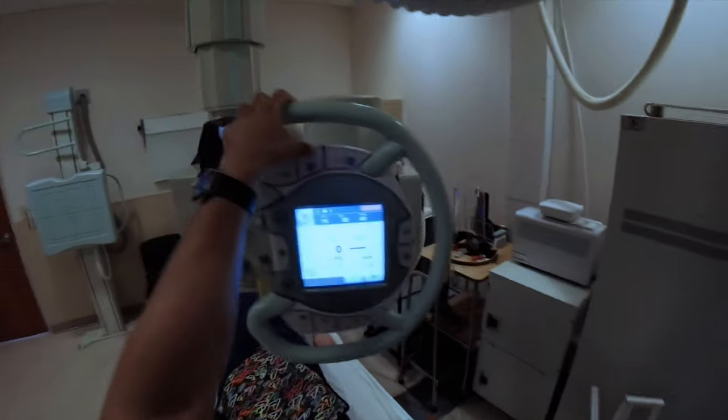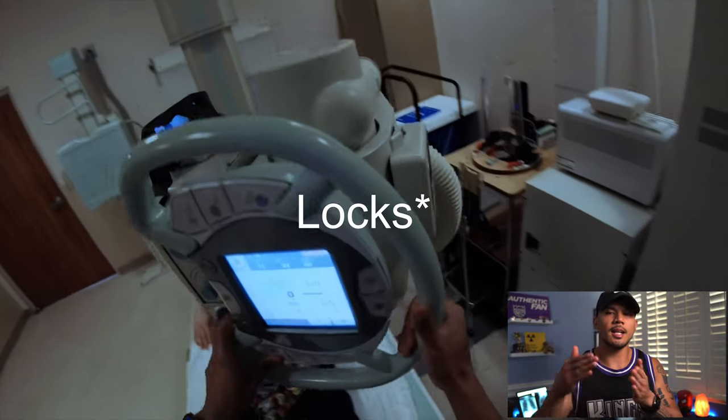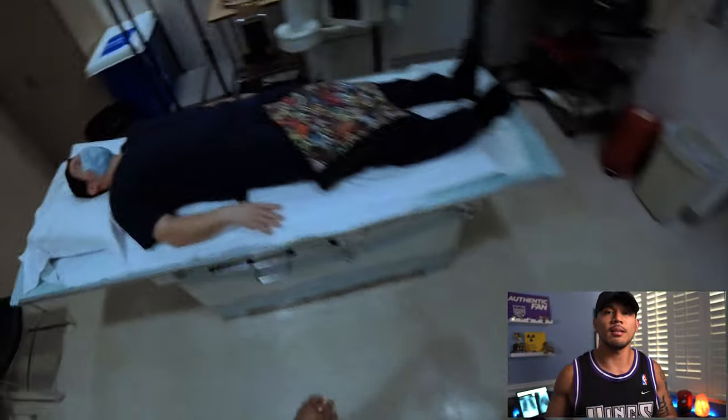Okay. So as I'm bringing the tube over, our tube detents at 90 degrees. So once it detents at 90, I kind of just bring it halfway, and that's 45.